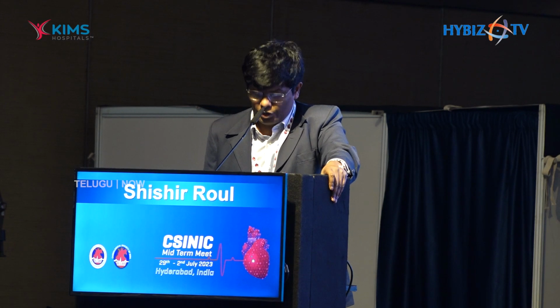If I didn't snare it, it could migrate anywhere. So looking ahead, I thought, let me snare it out. I made an indigenous snare, and with its help I was able to take the stent out, and the deployed stent and the second stent came out as a piggybacking of the stent. You can see the crumbling of the stent, and the whole 3.0 by 48 stent came out piggybacking. So this is a piggybacking stent. Finally, I went ahead and deployed the distal stent with pre-dilatation, then one more stent, and post-dilatation with flaring.